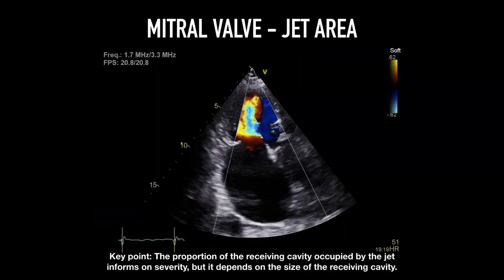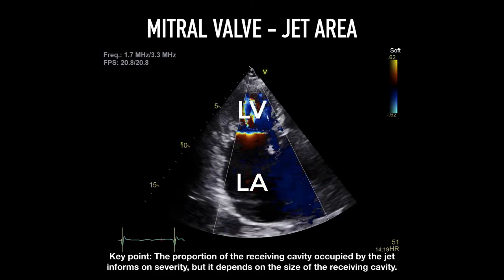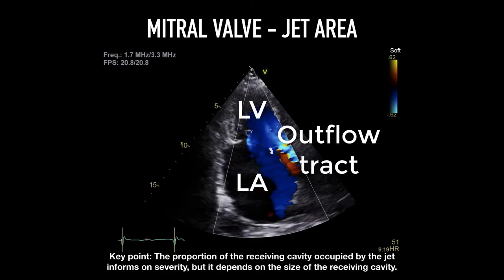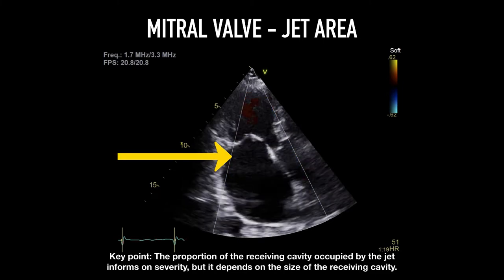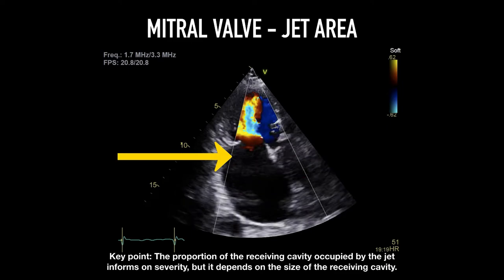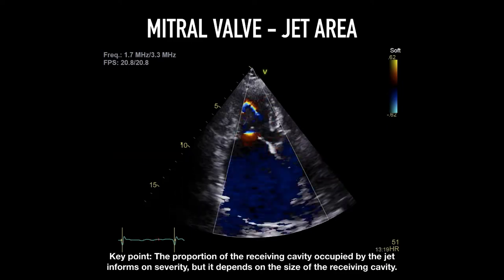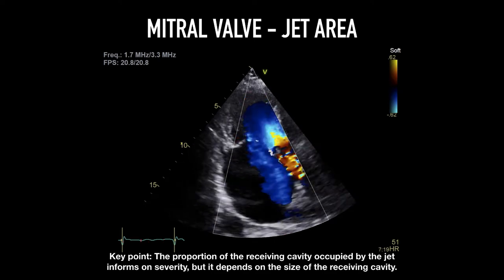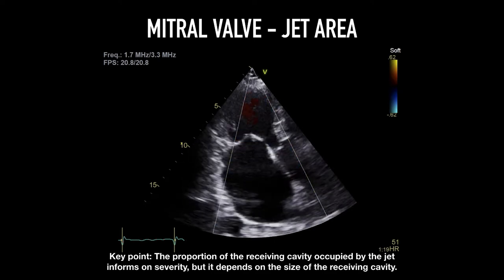This is an apical 3-chamber image where we can see the left atrium, left ventricle, and outflow tract. The jet area in the receiving cavity can be used to quantify the severity of regurgitation, with increasing size correlating with increasing severity. The caveat is that the size of the receiving cavity needs to be accounted for, such as in the case of severe mitral stenosis with probably moderate MR in a severely enlarged left atrium.